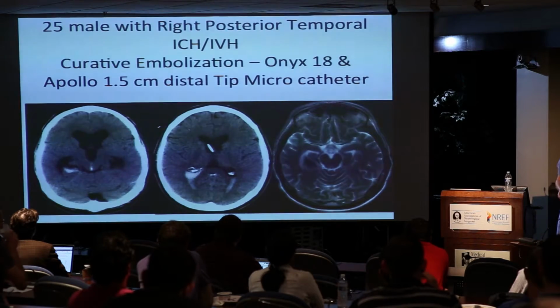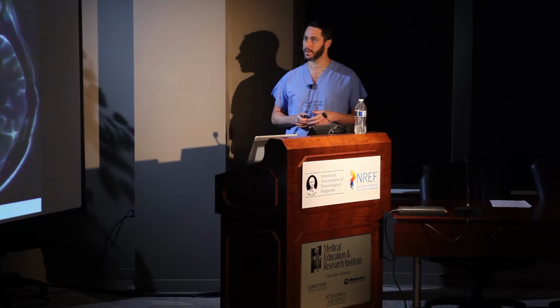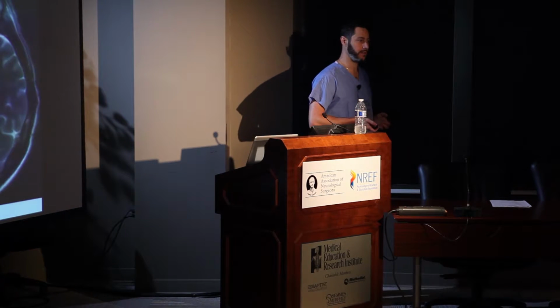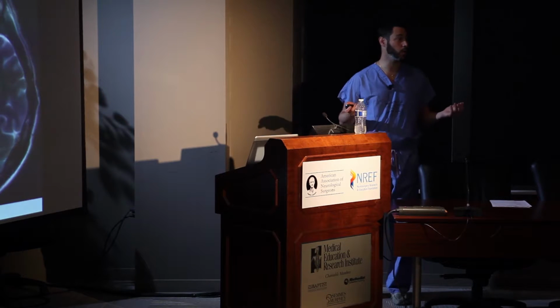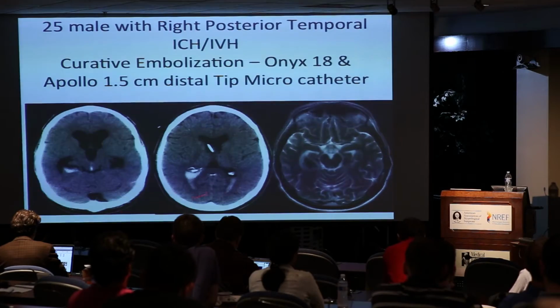Apollo has been available in Europe and other places for a long time, but the detachable tip microcatheter allows us a little bit more safety. But I'm sure you could do the same thing if you didn't watch your reflux past the marker. Okay, so this is a young guy who comes in with this hemorrhage, posterior temporal lobe, intraventricular.